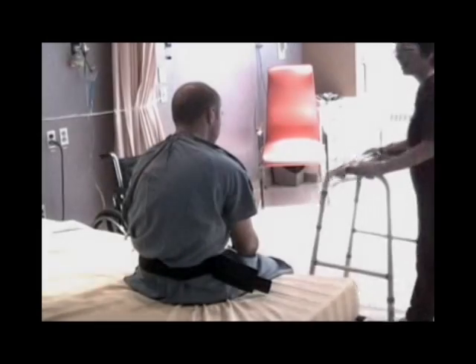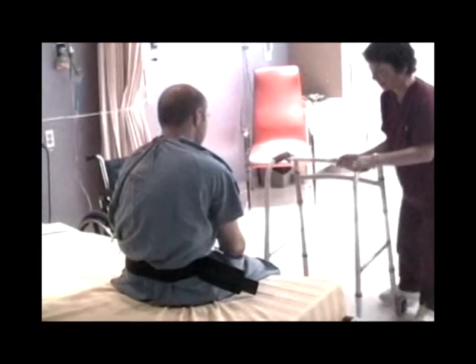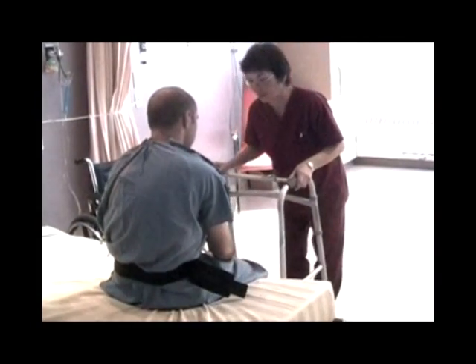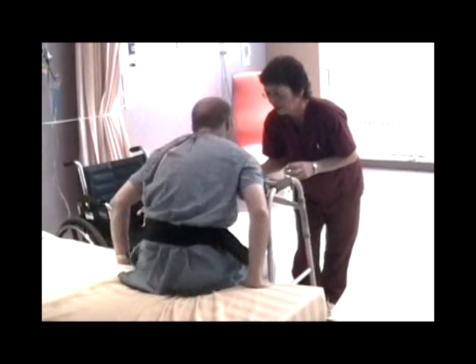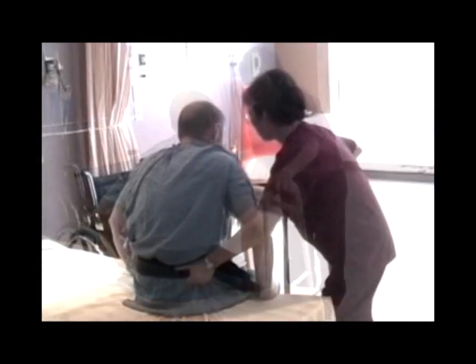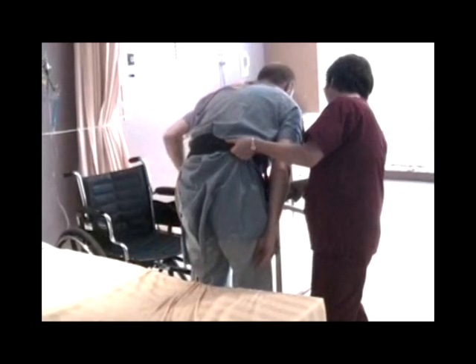Procedure for walker transfer. Prepare the environment, prepare the patient, and prepare yourself. Place the walker in front of the patient. Stand on the patient's weaker side, holding the belt at the patient's front and back. Instruct the patient to lean forward and push up off the bed and gain balance before holding onto the walker for support.